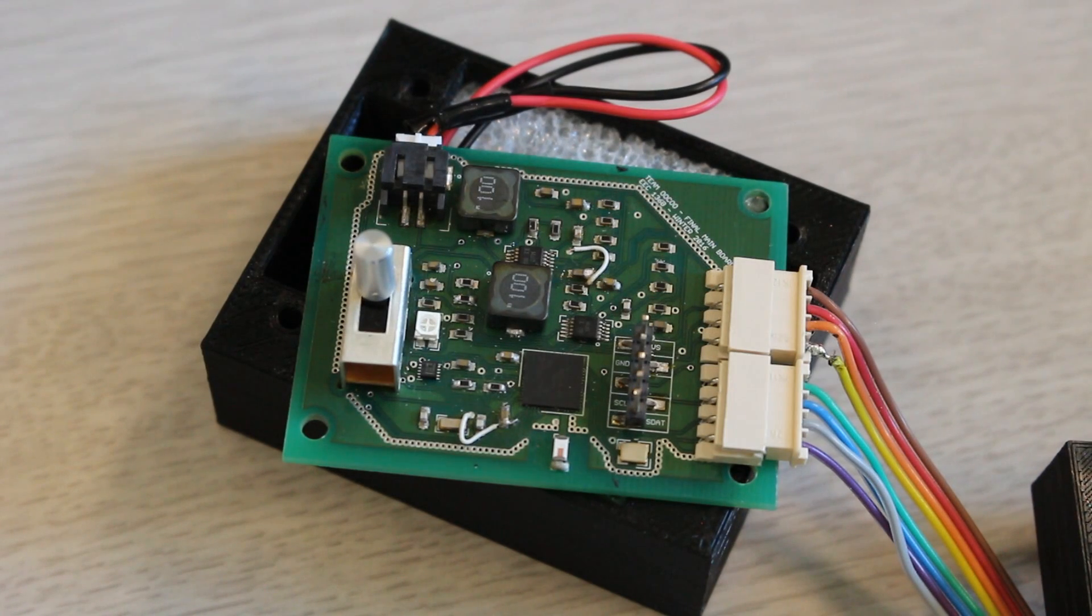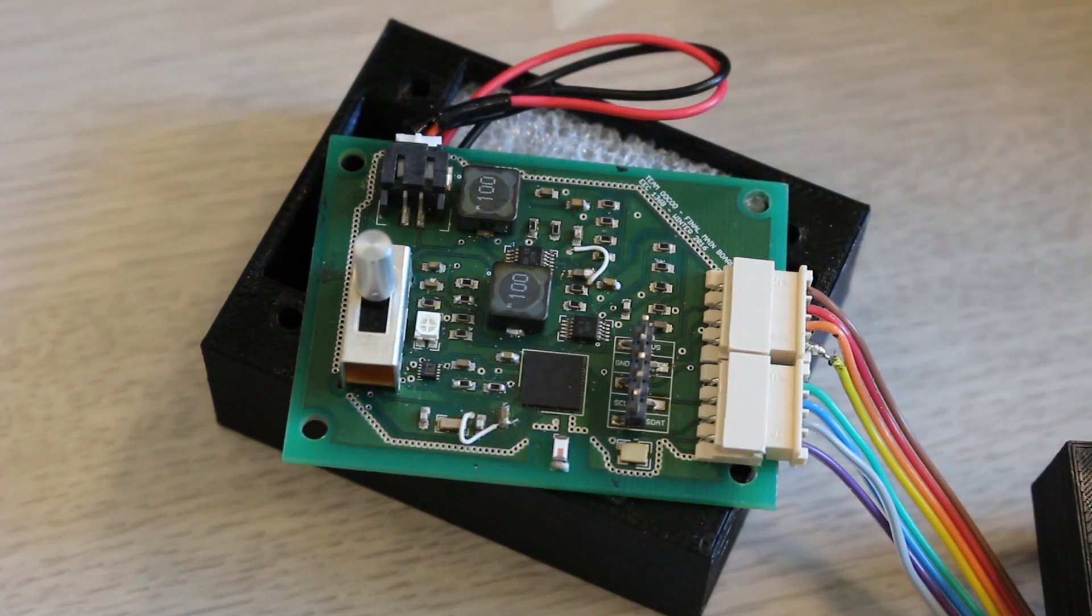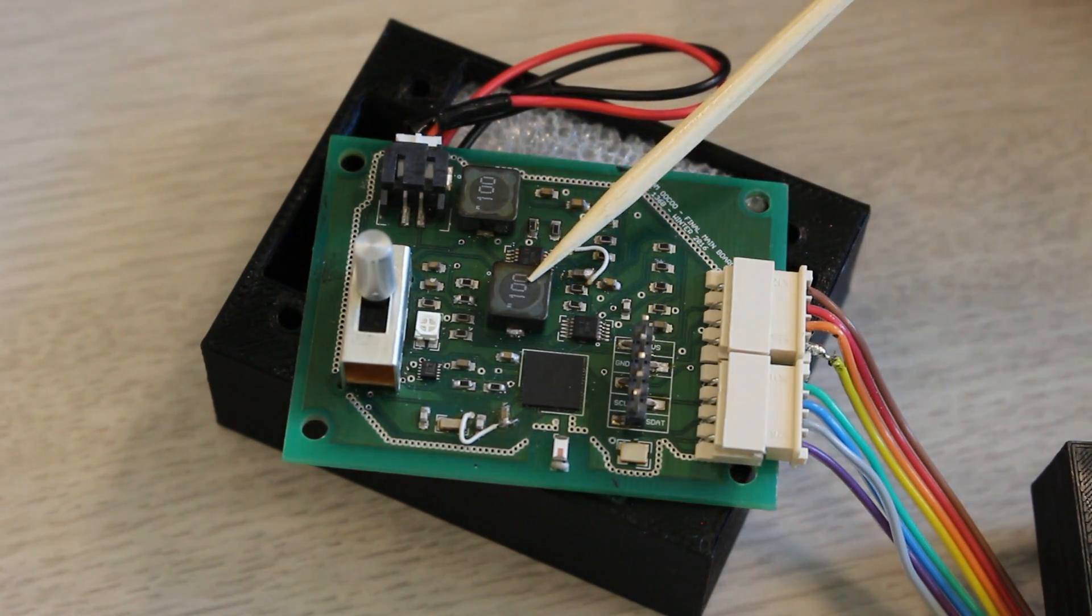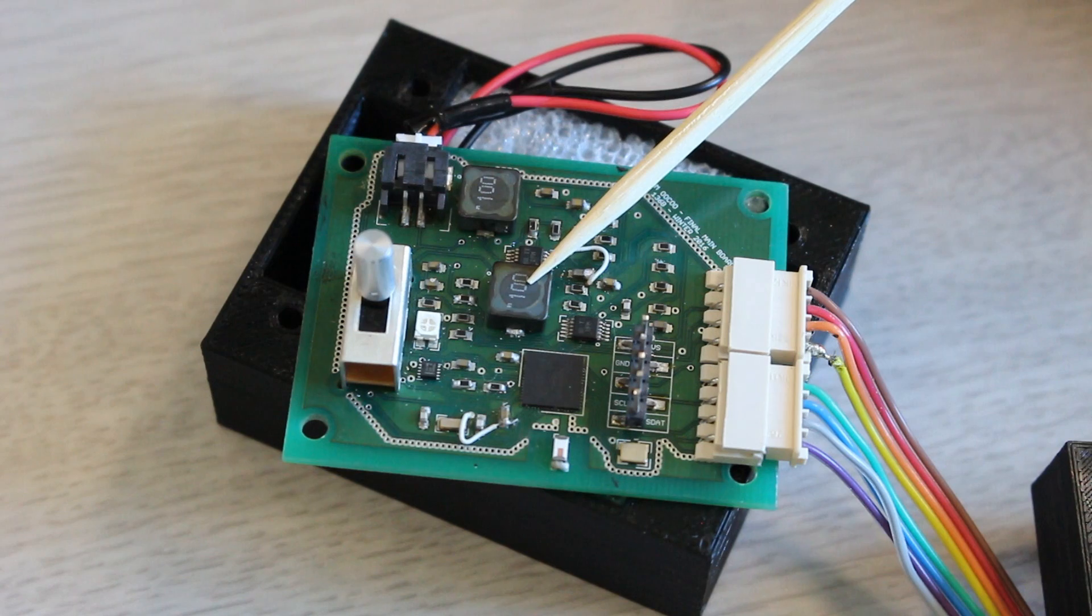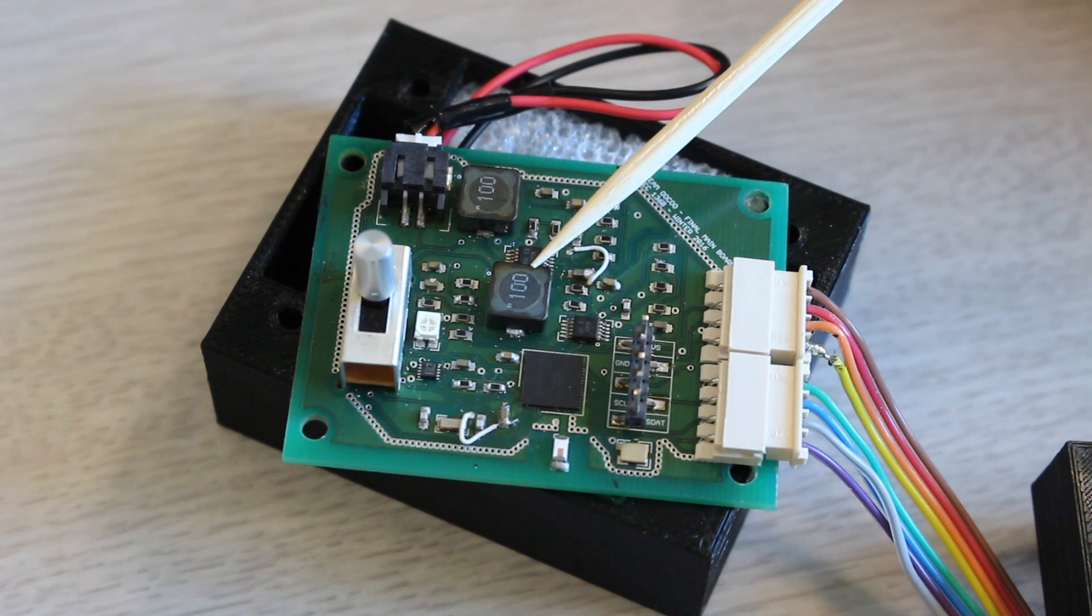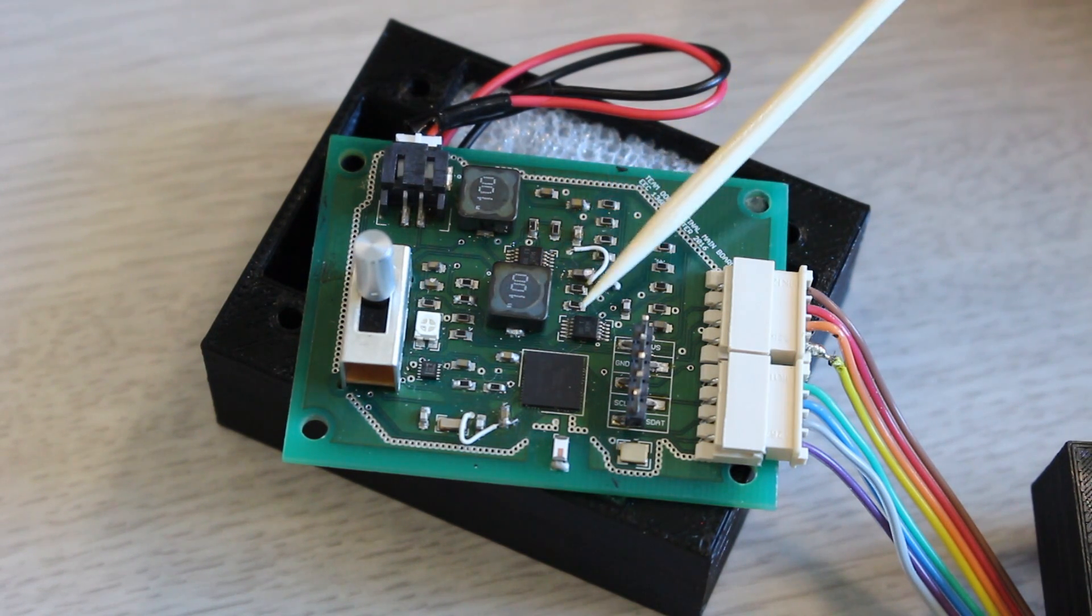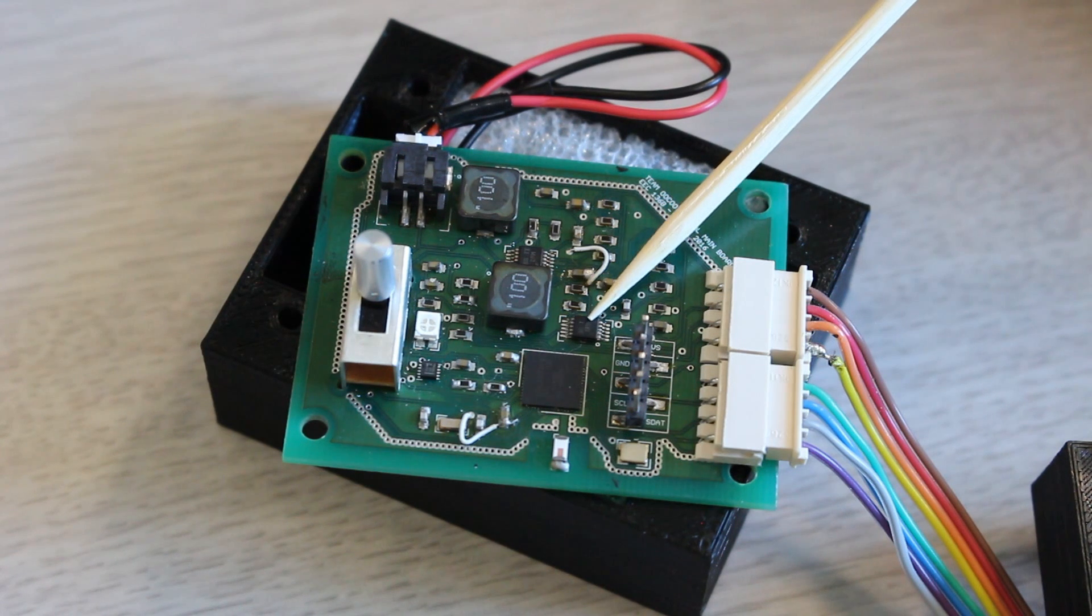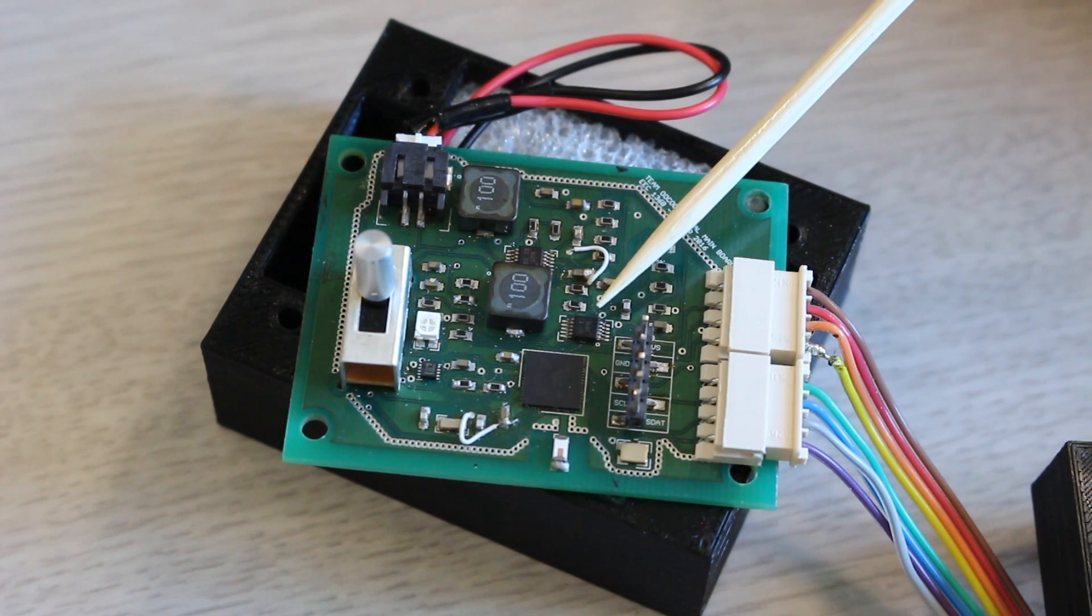This is the main board used in the OOCOO system. Starting off in the center of the board you can see a large inductor. This inductor belongs to one of our two regulating circuits. This regulating circuit takes in 9 volts and steps it down to 5 volts using a switching regulator.